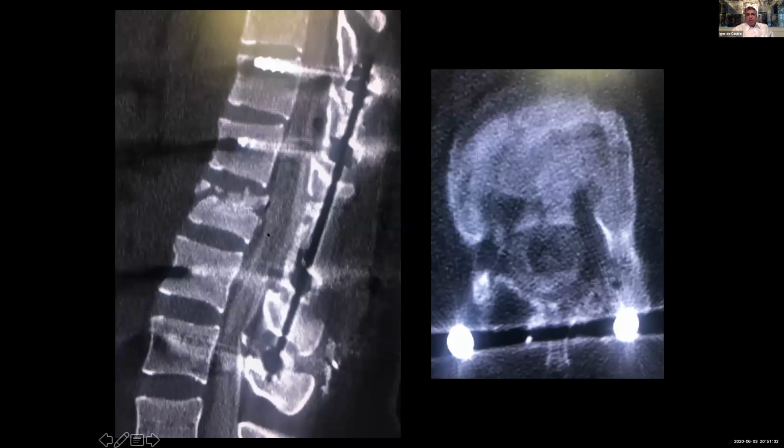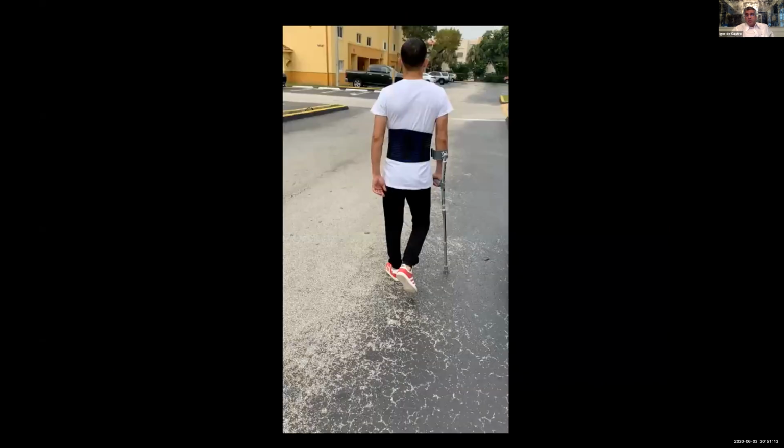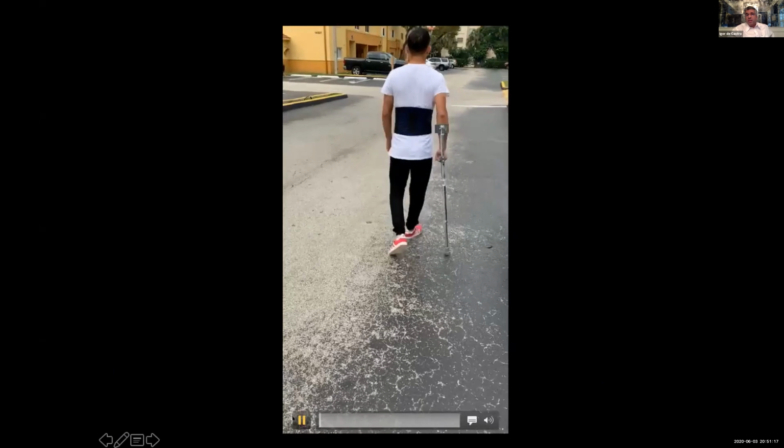Because of liability, I was afraid; this patient already had the first surgery, really trouble. We shot a myelogram, and you can see the reduction was really good after we decompressed and distracted this patient. The canal was really good with the myelogram. So I was happy. And it took 6 months. He went to Miami. He's a jockey, and it took 6 months, but that's the result that we have.